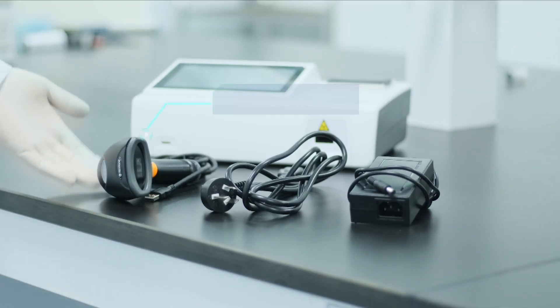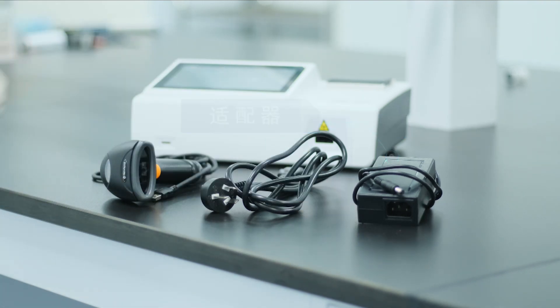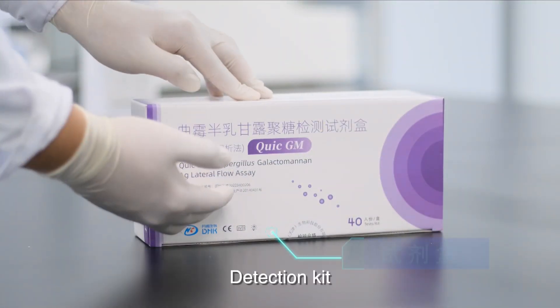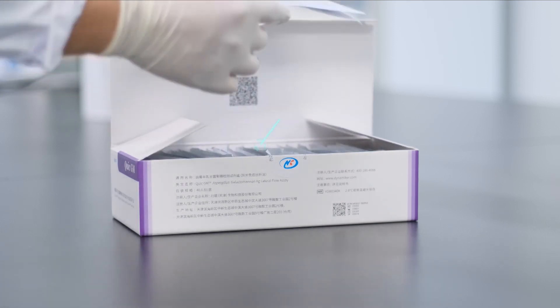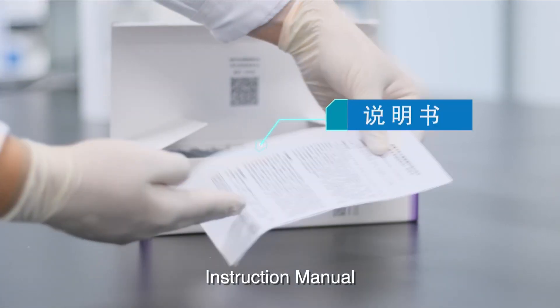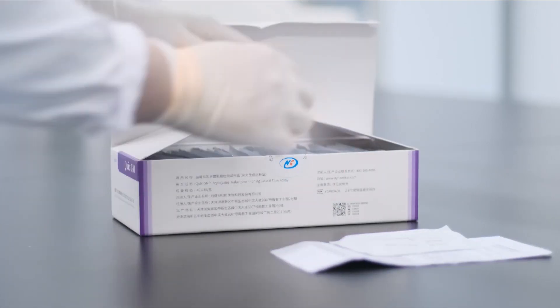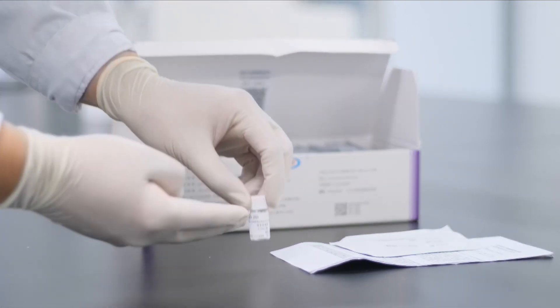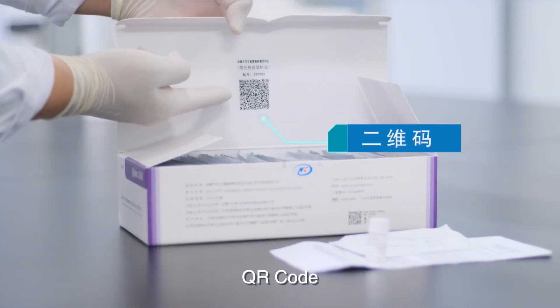The required materials include: scanner, power cord, adapter, instrument, detection kit, instruction manual, test cassette, treatment solution, and QR code.